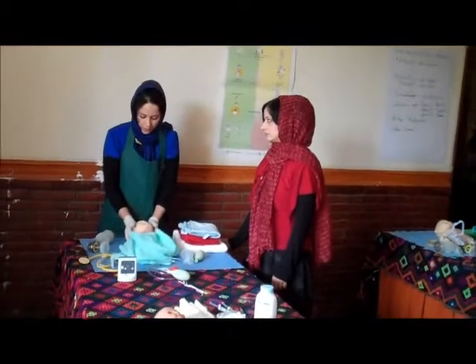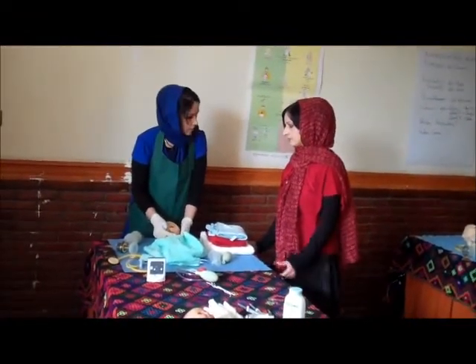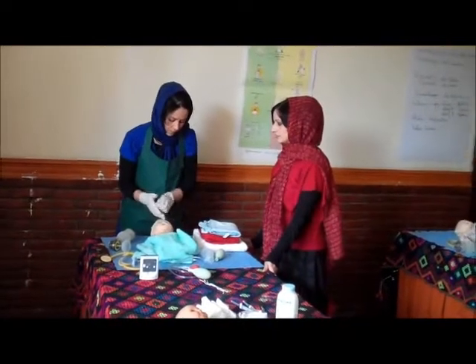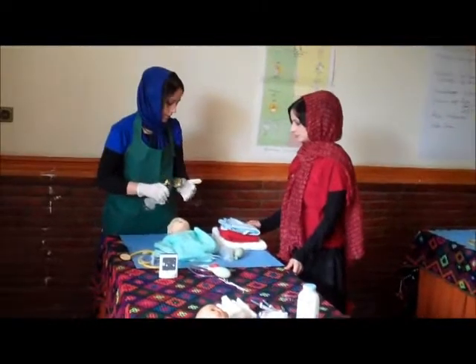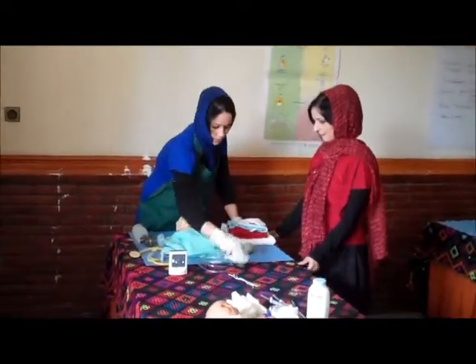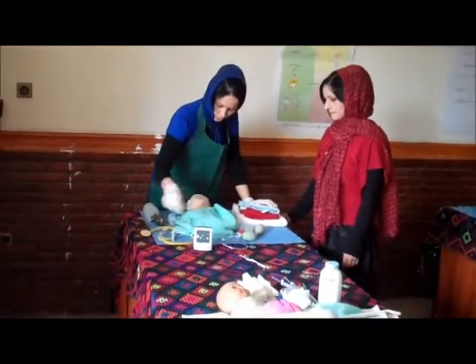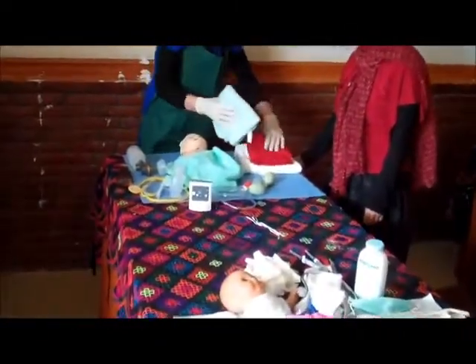Because when we want to ventilate the baby, we should be able to see the chest — whether it rises or not. We check that the bag is working. At this time, we have equipment like a watch, a stethoscope, and suction — anything we need for the resuscitation.